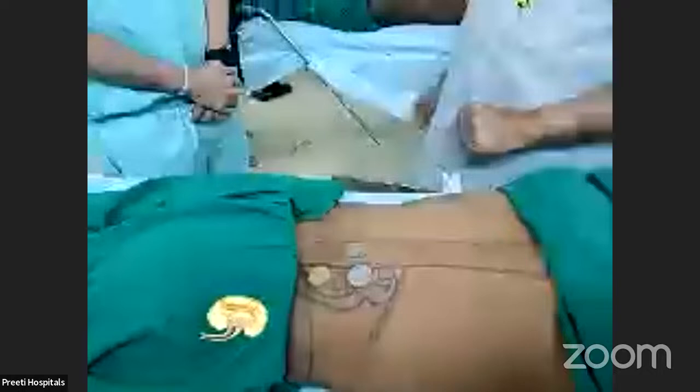I differ with you because I am doing supine PCNL more. I try the middle calyxial stone, remove the middle calyxial stone in supine, then remove the pelvic stone, and I will try to turn from middle calyx to inferior. If it is a larger than obtuse angle, I can remove that. Or else, prone PCNL. For the inferior calyx, prone is good, supine is also good.